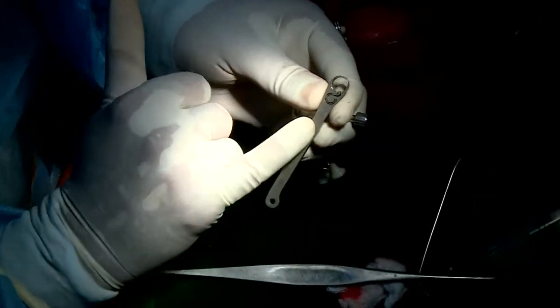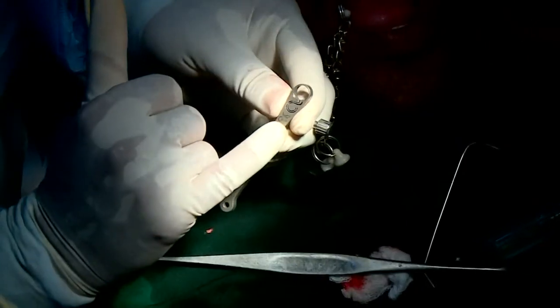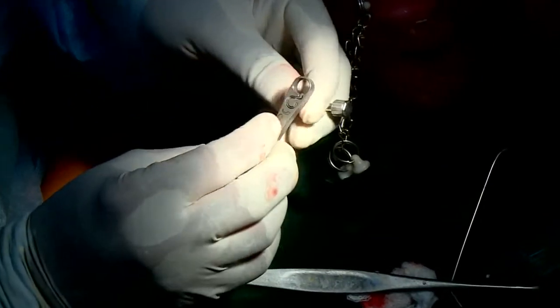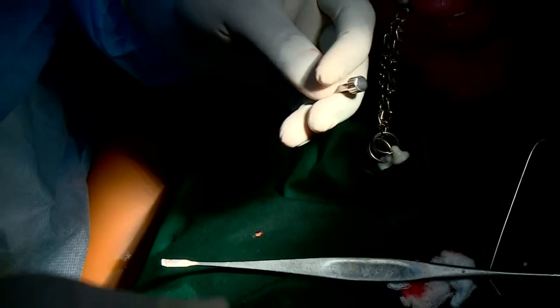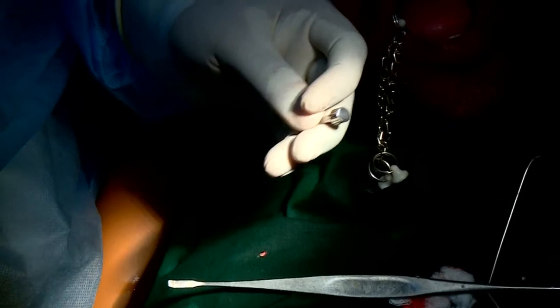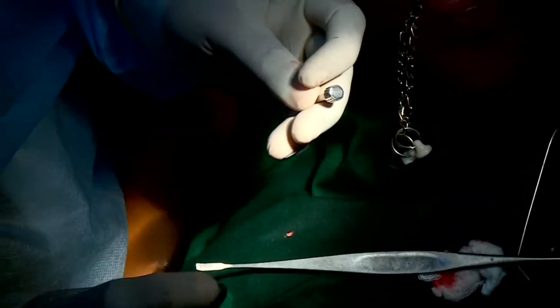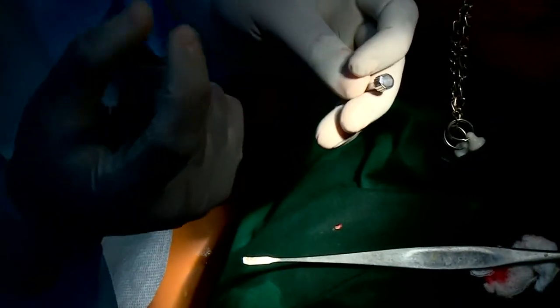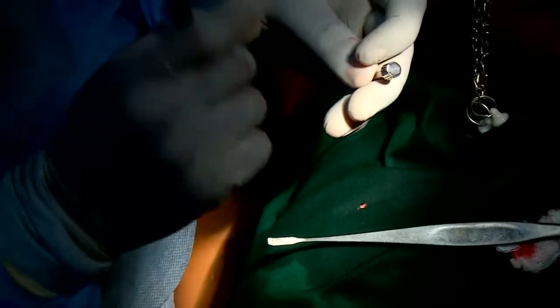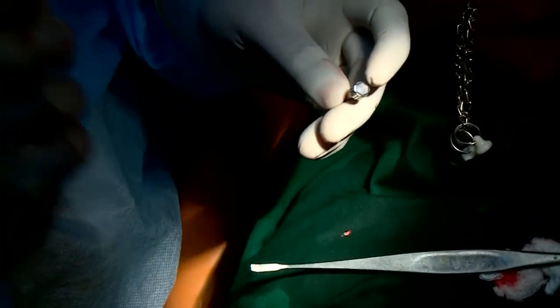Now, if you look at it, here it says out. If I have to remove an implant, in other simple words, what I told them is, I will try placing my implants, but I cannot torque it beyond 45 or 50 newtons. If I give all the force that I have and drive an implant, I will lose the thread on the inner side. My implant might become useless. So don't use your might, use your brain.